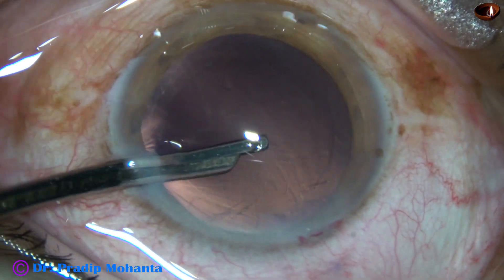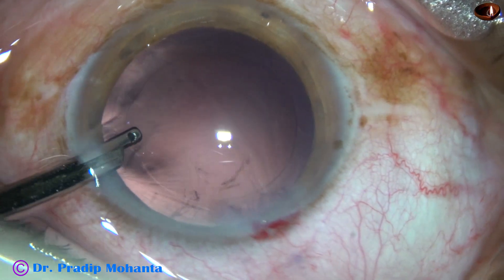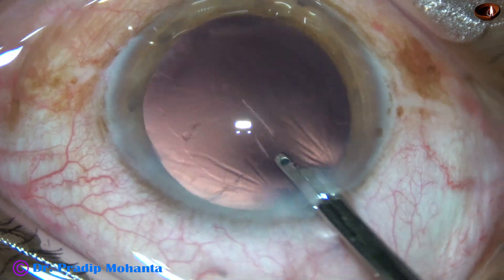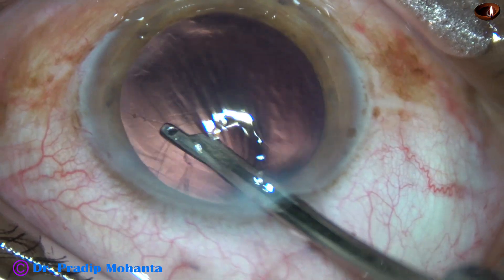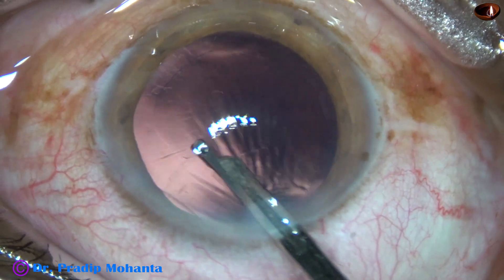Cortical clean-up has been done with a 23G Simcoe cannula. And now this is a little bit of lens fibers, and they are removed.